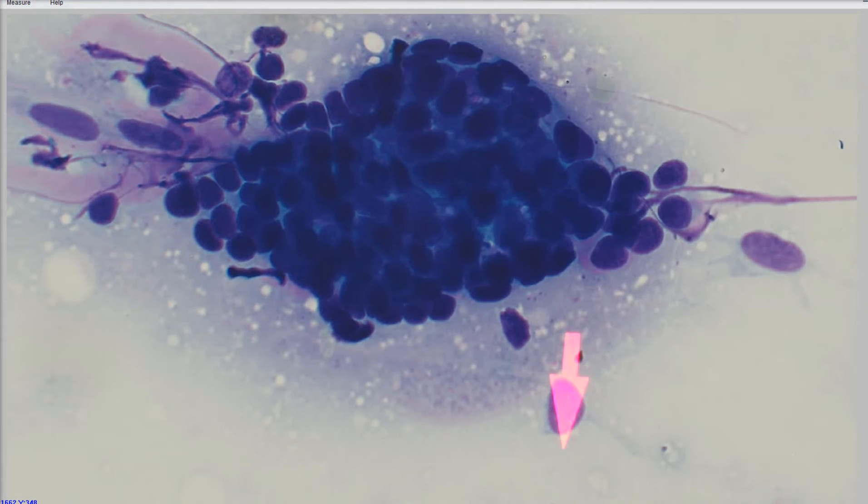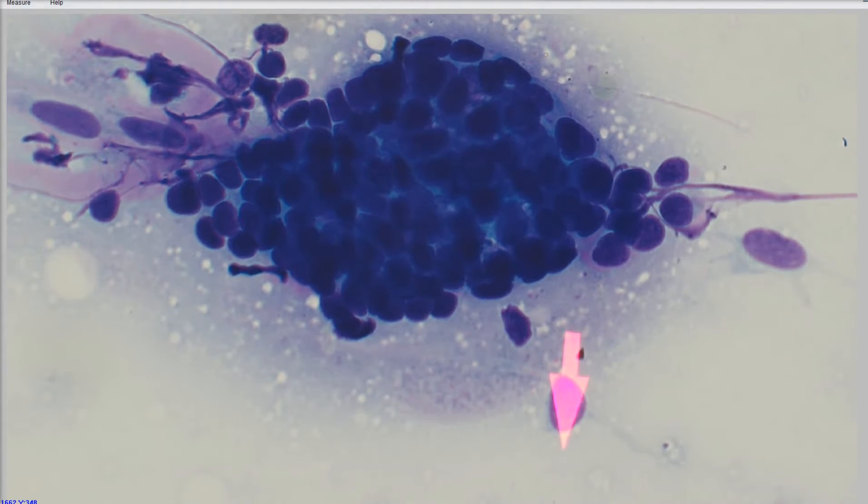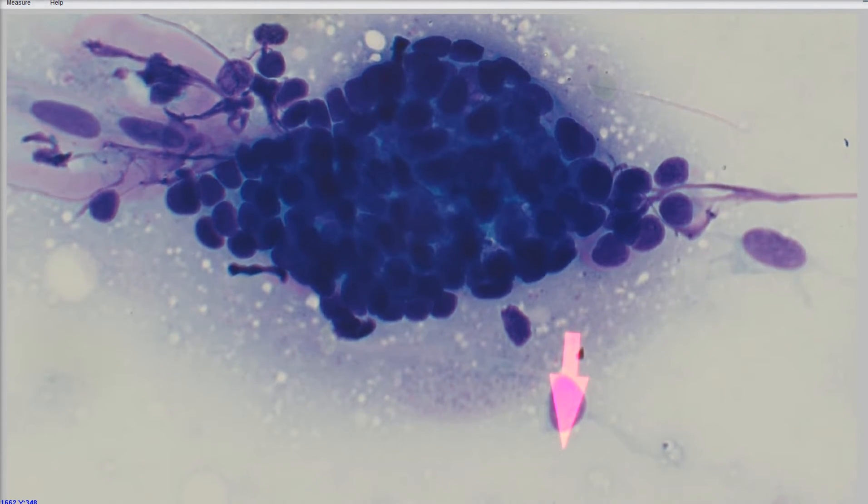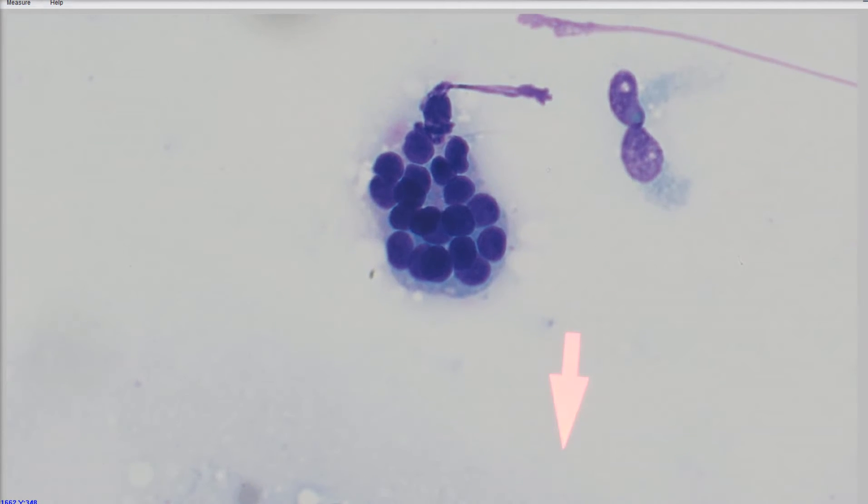So we have all these basal epithelial cells. This would be consistent with a trichoblastoma, also called a basal cell tumor in cats mostly, is what we still, we call it a basal cell tumor in cats, but in dogs we're classifying them now as trichoblastomas. And there are other types of follicular tumors that can have basal epithelial cells in them. So I don't always just straight up call it a trichoblastoma. I just suggest, you know, it's a follicular tumor.